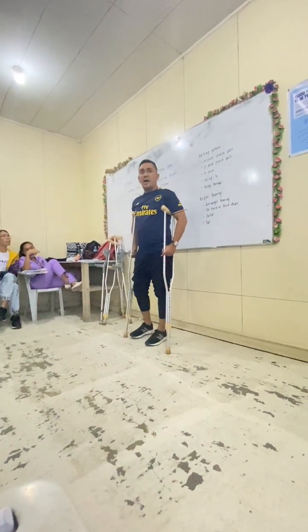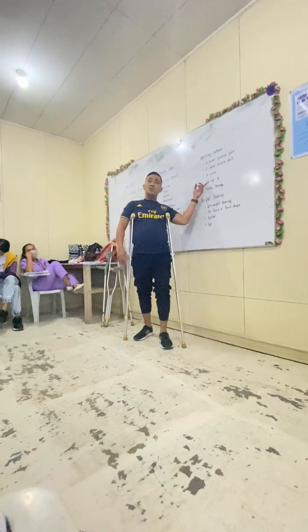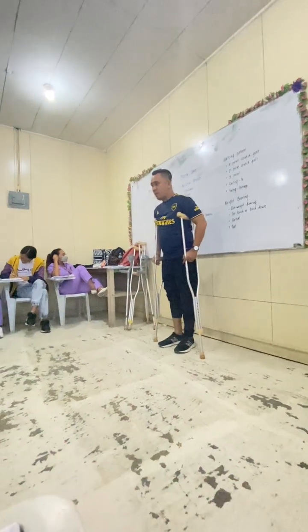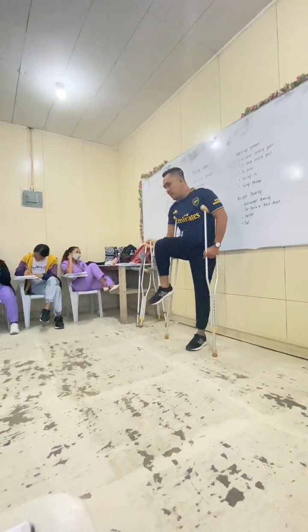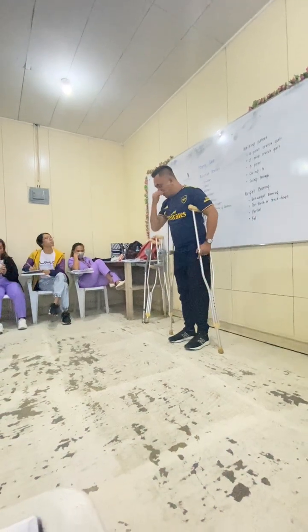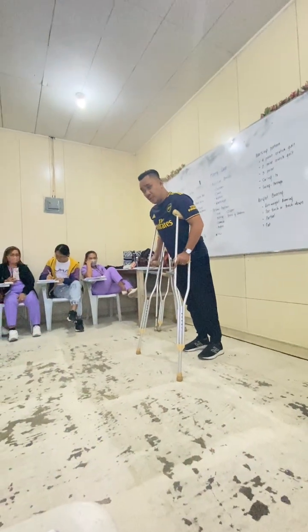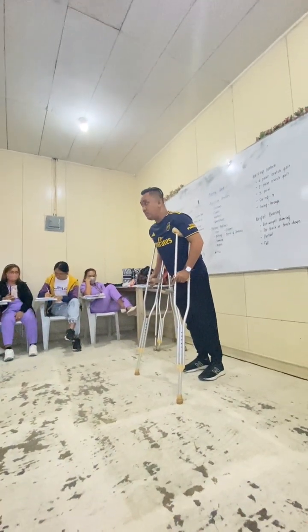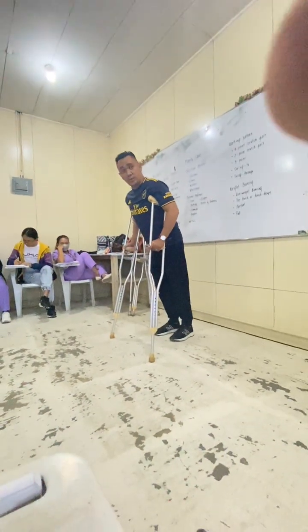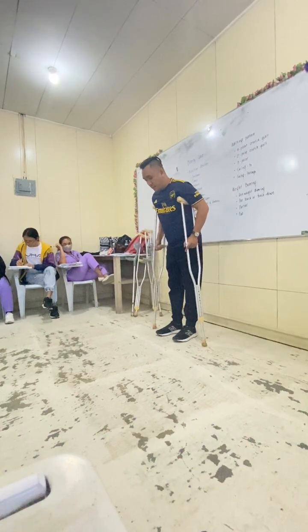Okay? Ang first walking pattern katulad ng patient if both legs are injured is the swing to. Swing to sa iyang unahon para ma-familiarize niya pag-balance on how to use the assistive device, the crutches, the axillary crutch. Okay? So how do they walk? So both crutches move forward na siya. Next one is both feet will be moved na siya. But kutob na siya din sa crutch tips or crutch level lang. Gets niyo? So dili siya mo lapas.